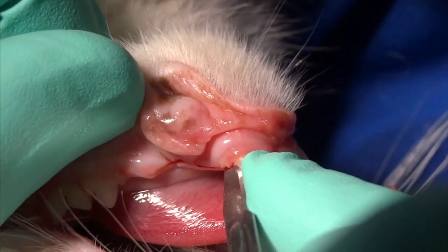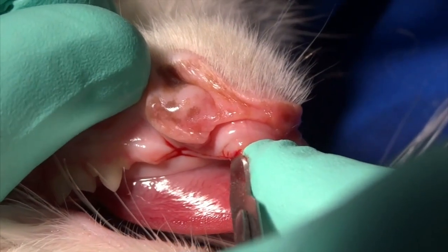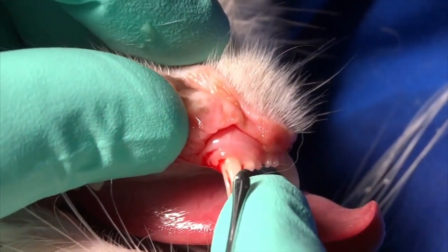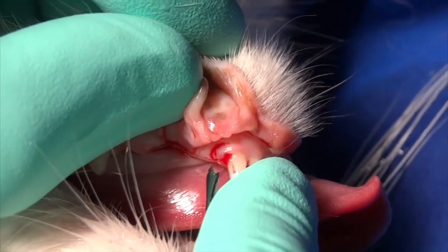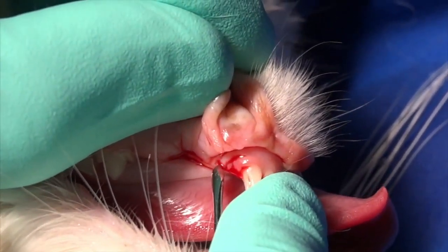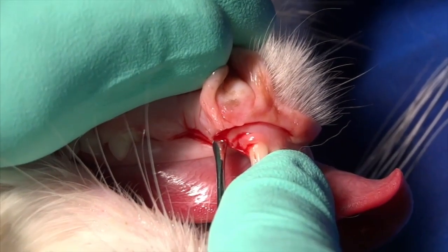As we're progressing through here, we've made an envelope incision. We're not going to be doing any vertical releasing incisions — we don't need to do that to extract the mandibular canine tooth. This is exactly the same approach as we would take if this were not a tooth with tooth resorption. We want to expose the bone and get down to where we saw that differentiation between the resorption portion of the apical one-third and the rest of the tooth.